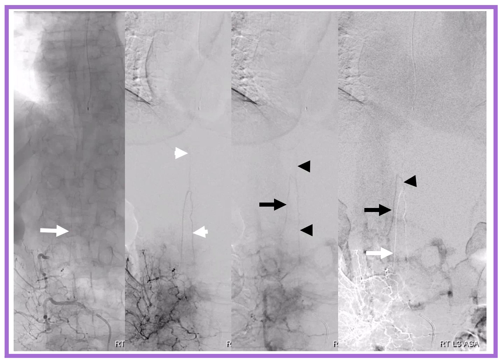It is one of these weird facts that the radicular vein is almost never at the same level as the radicular artery, probably just by chance alone. You can see them separately, right? So fine. Now we found the anterior, we've defined the anterior spinal axis to maybe T11 and then down.